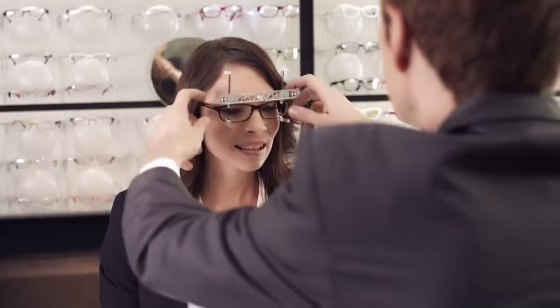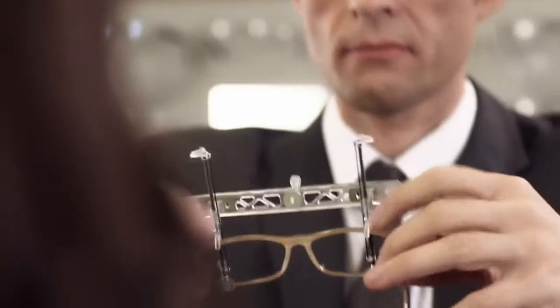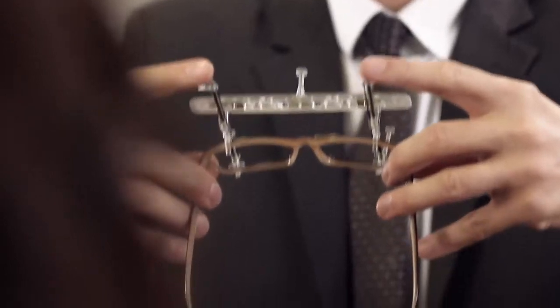Once again, take off the frame with the measurement tool attached. Check if the tool is placed exactly in the middle of the frame.